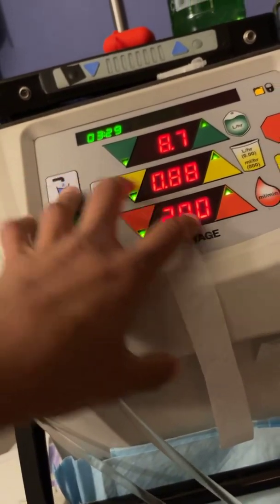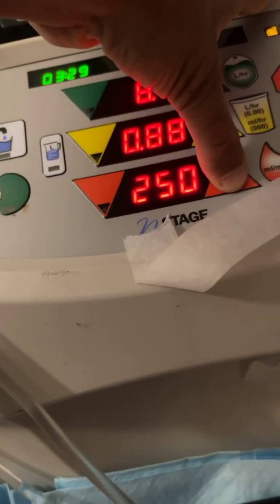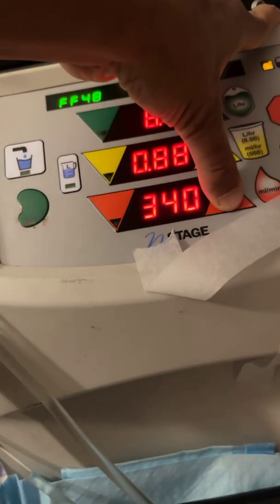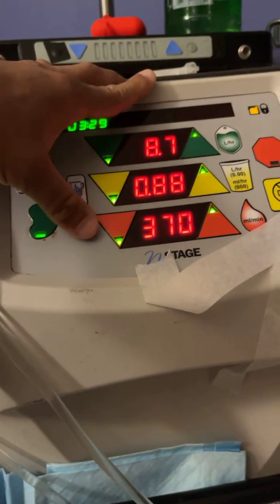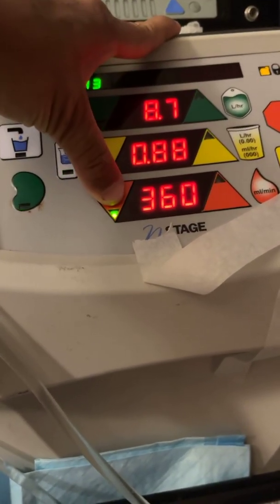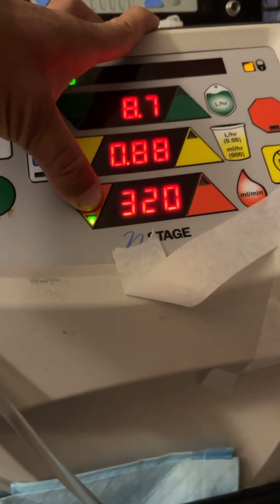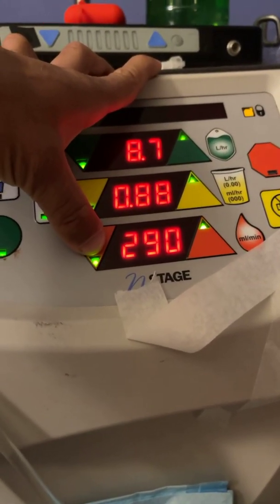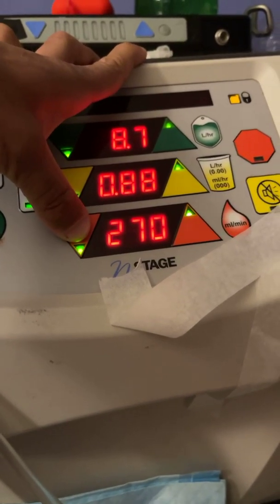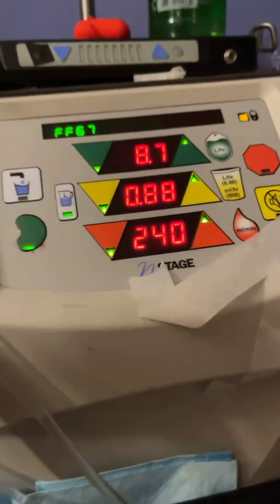my blood flow rate to 380. So this is gonna go up to about 380. No, I'll put 370. I'll put 370 for about an hour in the treatment. Then when I have 2 hours left, I'll reduce this to about 330. Then when I have 1 hour left, I'll reduce this to 290. Then when I have about 30 minutes, reduce it to 270. Then when I have 10 minutes, I reduce it all the way to like 240. And there you go.